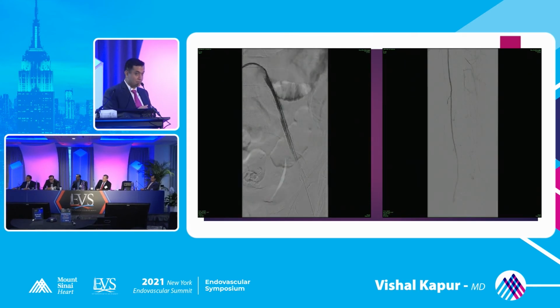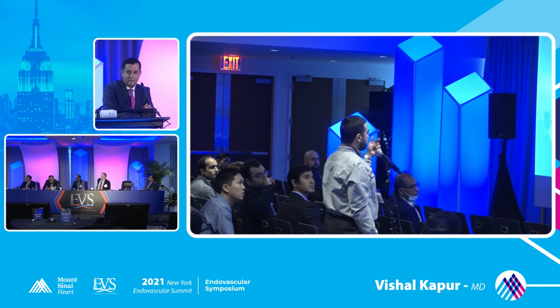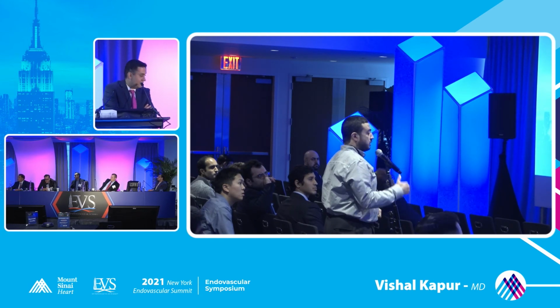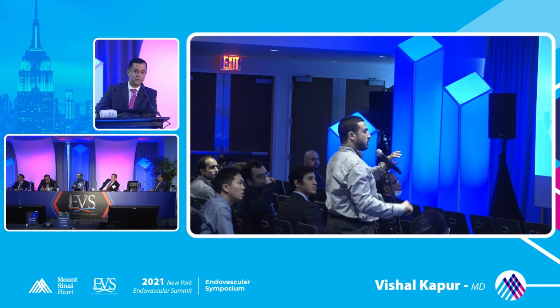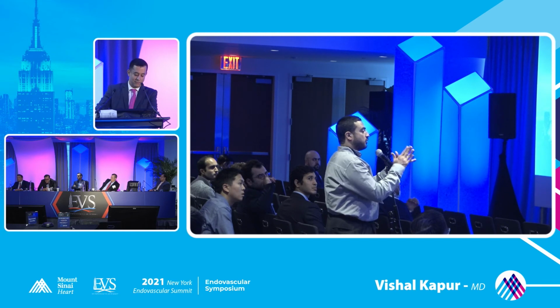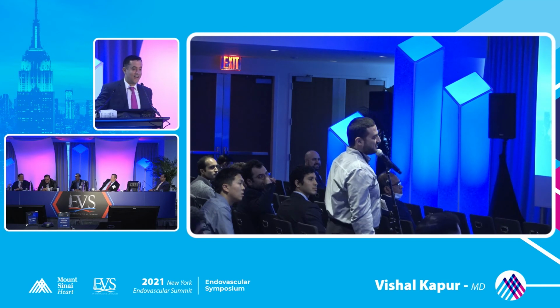I have a small comment. Sometimes in similar situations of thrombus in coronary, we control the heparin with protamine and inject glycoprotein 2B3A inhibitors or even lytic therapy. But remember, it's intravascular. No, but the patient had a perforation. Can't do anything. I speak about the thrombus after controlling the perforation, instead of covering the stent, as long as the perforation is already sealed. So you really trust your covered stent, huh? 100%. No. Wow. It wouldn't work for this.